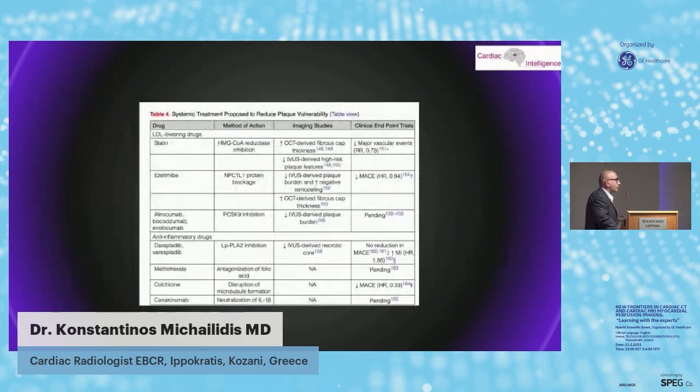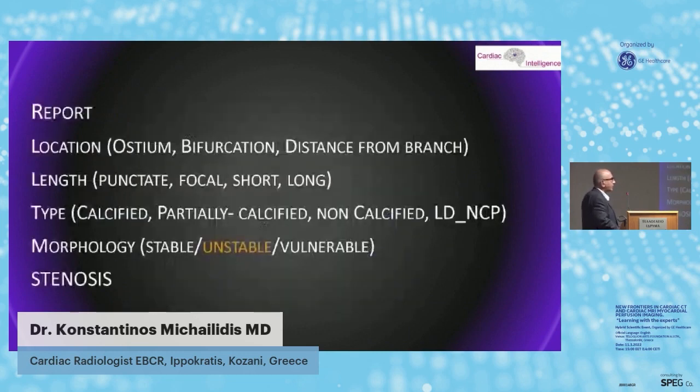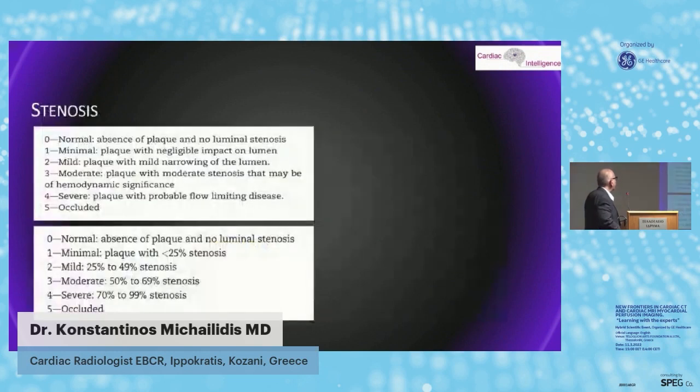And of course, we're really good with this because there are drugs that can change the situation. Statins or some anti-inflammatory drugs have been shown to change the fate of a vulnerable plaque. We have to report all plaques, all these different things, and of course report the stenosis.